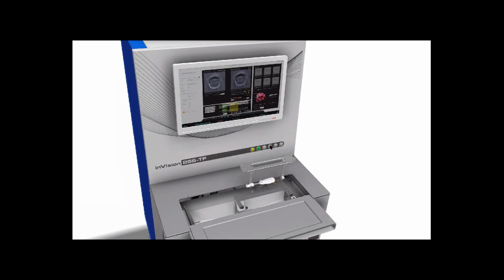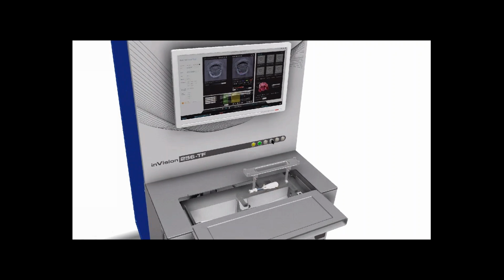The reason for doing this is that when the animal is placed into the system, it's necessary to put the holder into a water bath because there's a 2 centimeter distance from the surface of the animal's skin to the surface of our detectors. And since we do ultrasound imaging, we need to use water for coupling. But it's imperative that the animal neither gets wet nor is it at risk for drowning. So this cassette is both watertight and loosely fitting so it does not interfere with the animal's breathing. The water inside of the tank is also temperature controlled so we can maintain the body temperature at physiological temperatures.